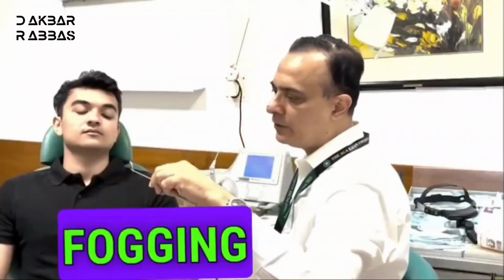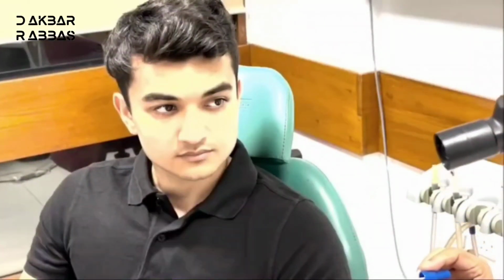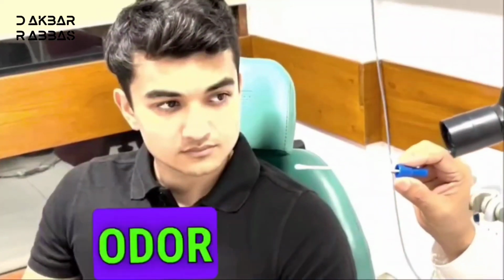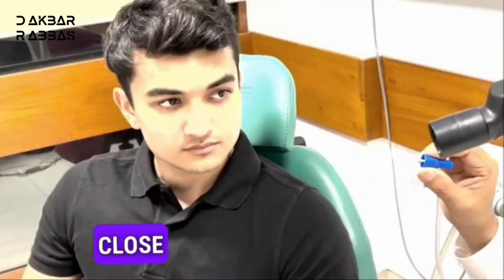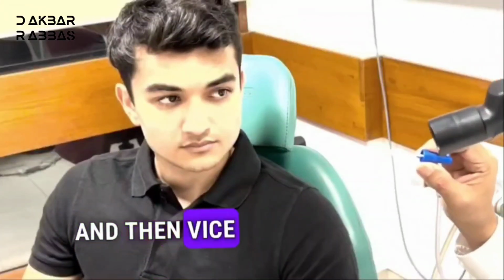We'll check for the fogging of the mirror. If the fogging is there, the nasal patency is there. So we'll be doing the test of olfaction. In order to do so, you can make use of a cotton swab and put some pleasant odor on it. Then ask the patient to close one nostril and check the patent nostril, and then vice versa.